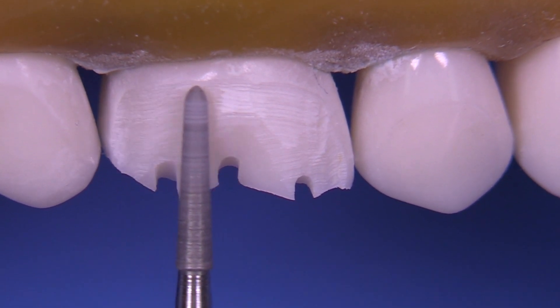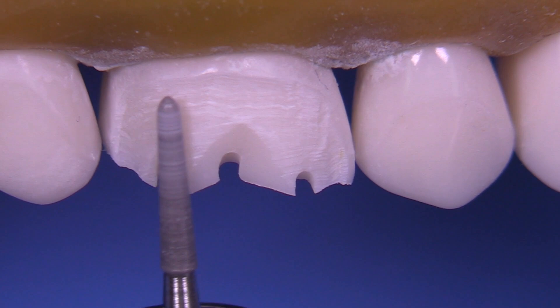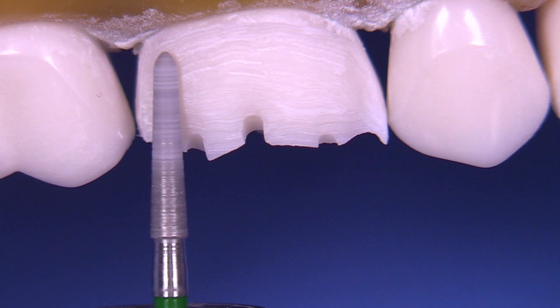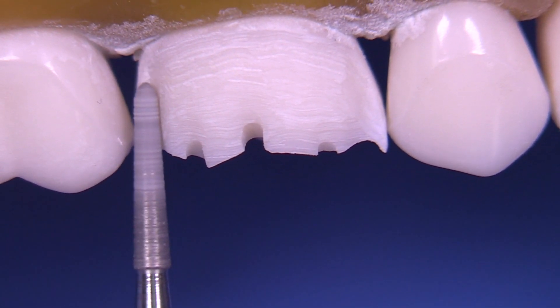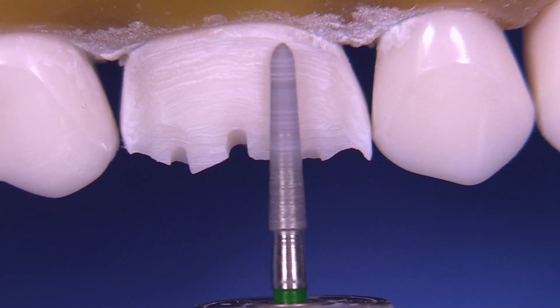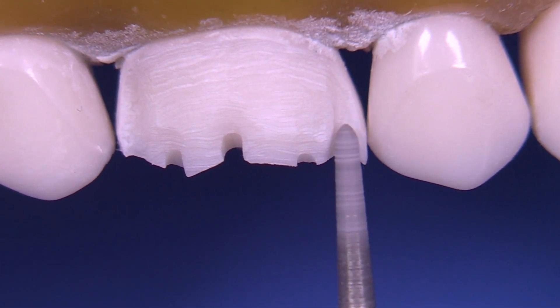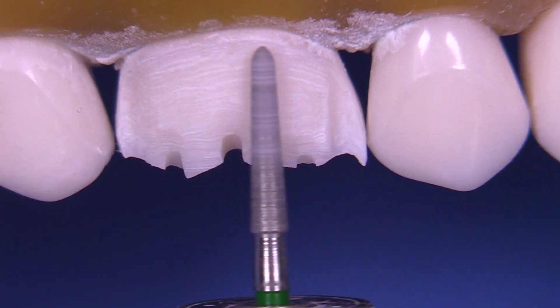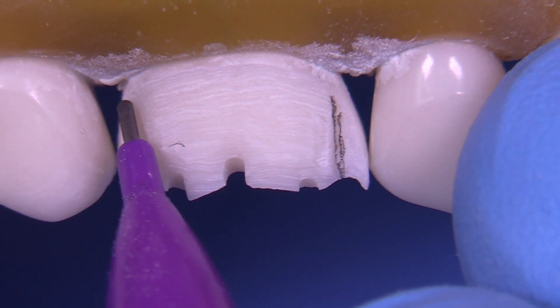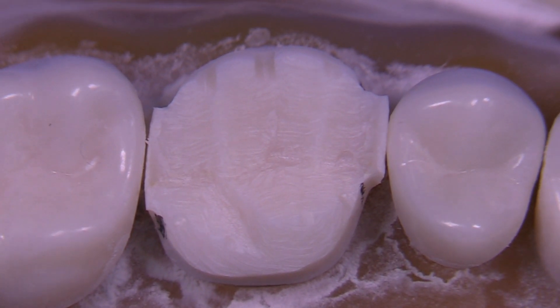What's really cool is you can focus on making a full gold crown prep first, and then make the modifications to the PFM. I do like to try to push the bur as far as I can interproximally, so that we can get a smaller proximal piece to remove with the needle-shaped bur later. You can take a pencil and run it inside this internal line angle and you can see your taper — you can actually visualize that very easily.